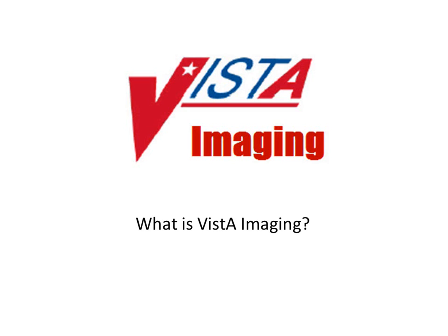So, what is Vista Imaging? Vista Imaging is an extension of the VISTA or RPMS Hospital Information Systems. Vista Imaging provides a means of capturing and displaying clinical and administrative images, scanned documents, motion images, and other non-textual data files, and making them part of the patient's electronic medical record.